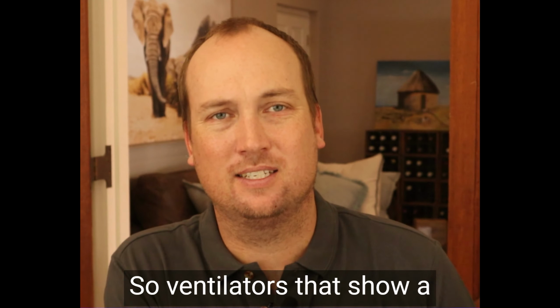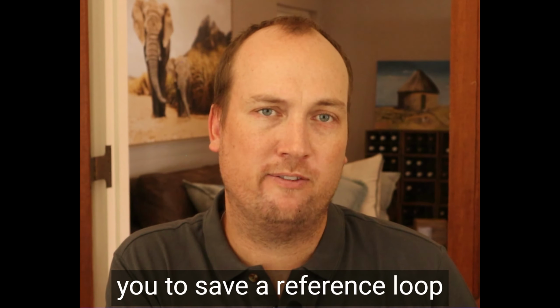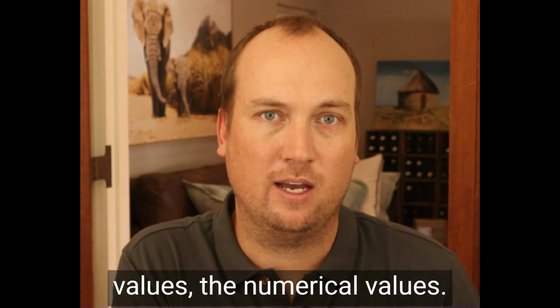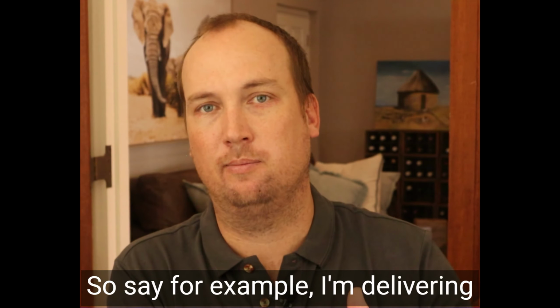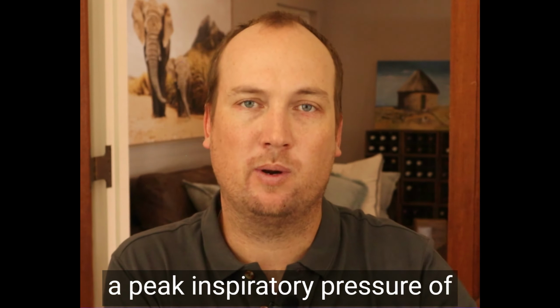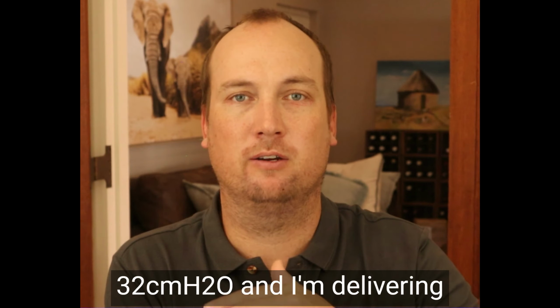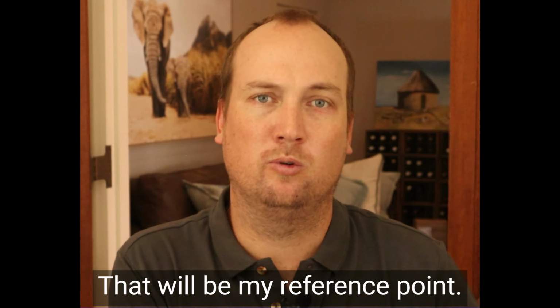So ventilators that show a compliance curve often allow you to save a reference loop, or I write down the actual numerical values. So what is my pressure and what is my volume? Say, for example, I'm delivering a peak inspiratory pressure of 32 centimeters of water, and I'm delivering a volume of 350 mils of air. That will be my reference point.